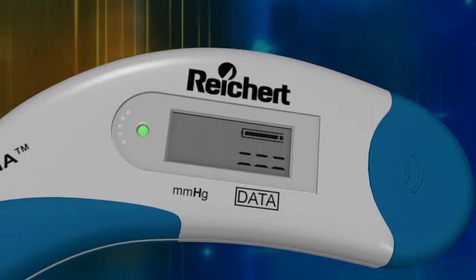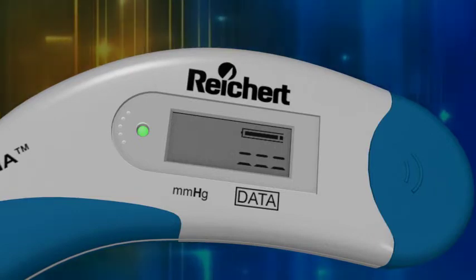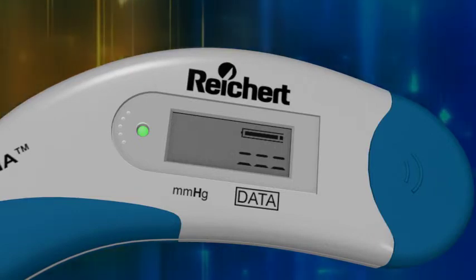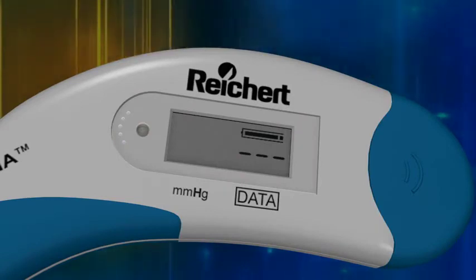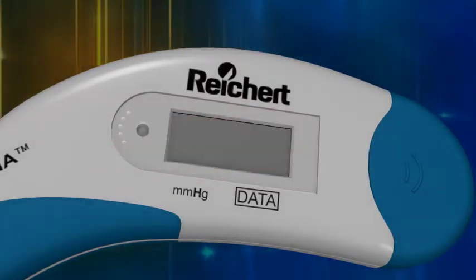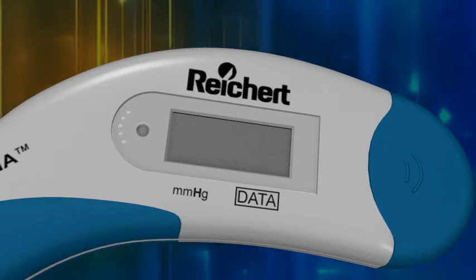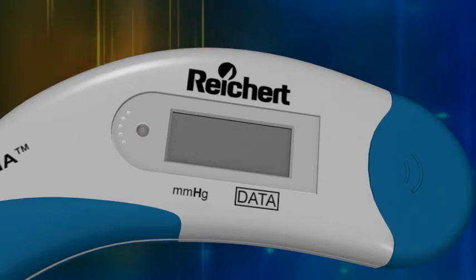You now have 15 seconds to begin the application procedure. If you exceed the 15 seconds, the Tonopena Via will beep, the LED will go out, and the LCD will display a single line of dashes followed by a blank window, indicating that the instrument is in battery saving mode. To re-initiate the measurement mode, simply press the operating button again one time only.